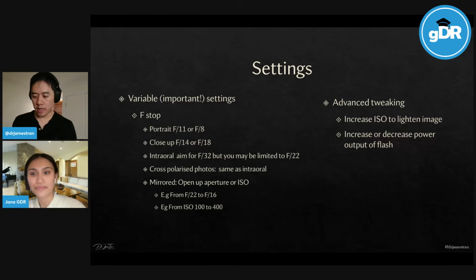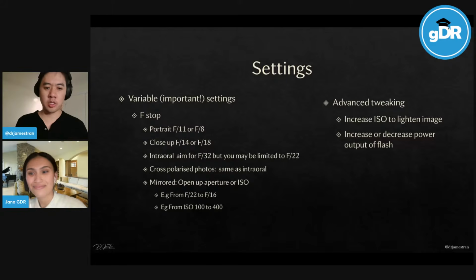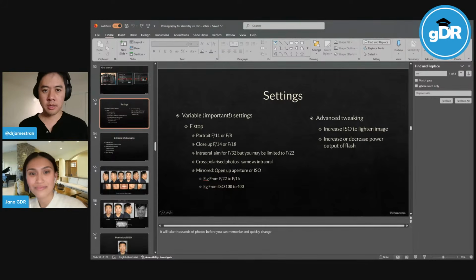So use that as your guideline, and then you test it out on a DA when you've got some time between patients, and then you will know which one is best for your camera and your lighting and your room size, because these factors play variables in how your photo comes out. But yeah, certainly start with this as a starting point.